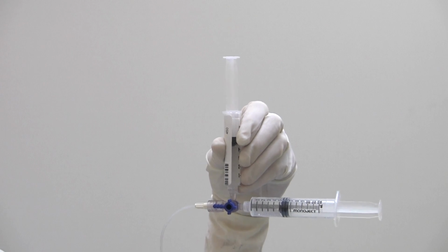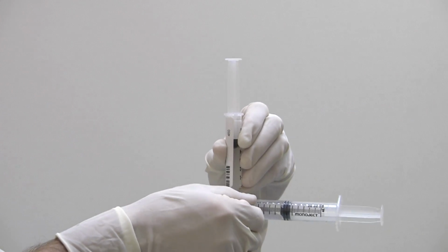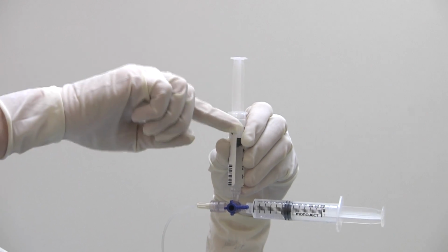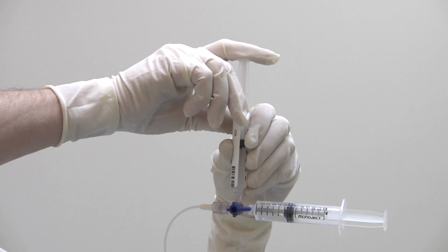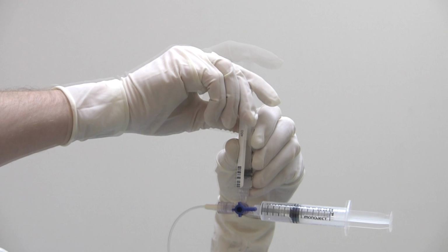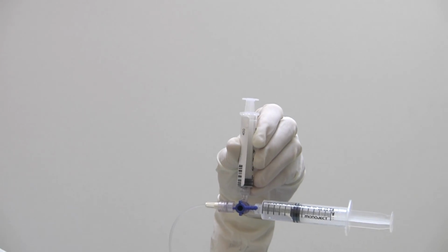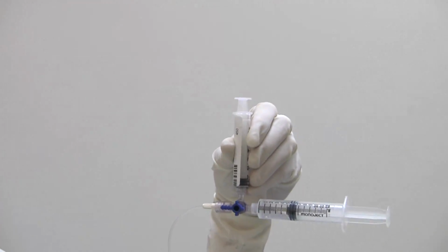Rotate the stopcock and use this 5 cc's of fluid to flush the chemotherapy through the chemotherapy syringe, the stopcock, the butterfly tubing, the reservoir, and into the intracerebral ventricles below. The flow should again be over 2 to 3 minutes without encountering any resistance. A total of 10 cc's of fluid is administered in this fashion. 20 cc's was removed for a net loss of 10 cc's of intracranial volume.